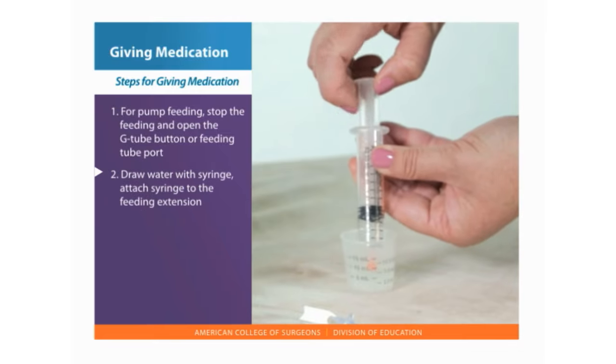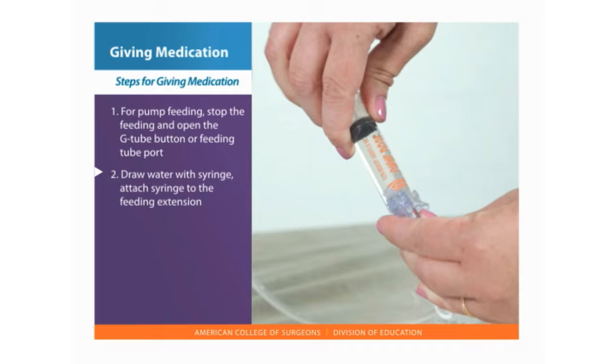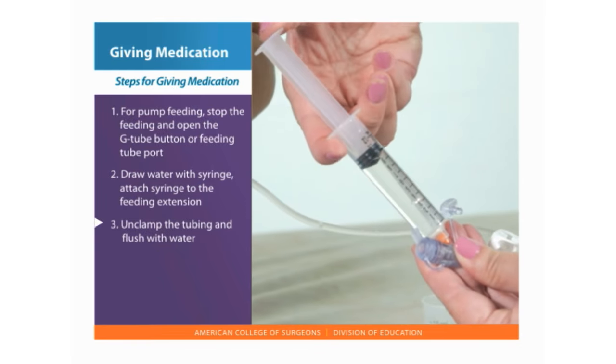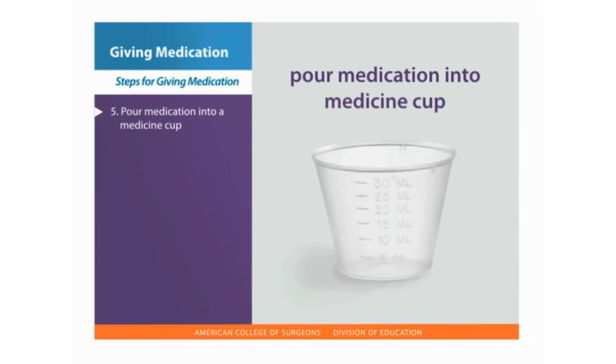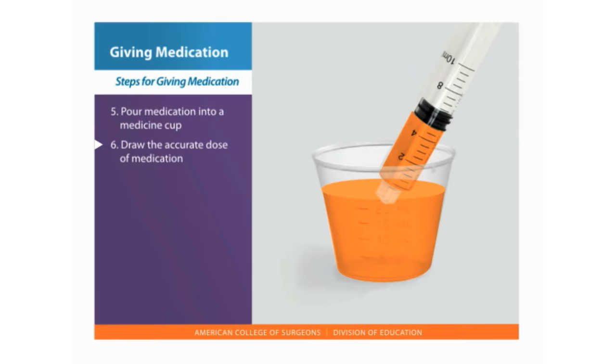2. Draw up the water in the syringe. Attach the syringe to the feeding extension or feeding port of a gastrostomy or jejunostomy tube. 3. Unclamp the tubing and flush with the water in the syringe. 4. Reclamp and remove the syringe. 5. Pour the required dose of the medication into a medicine cup. 6. Draw the accurate dose of medication into a syringe.